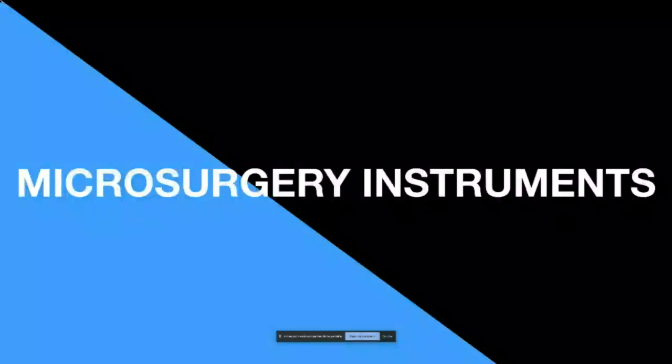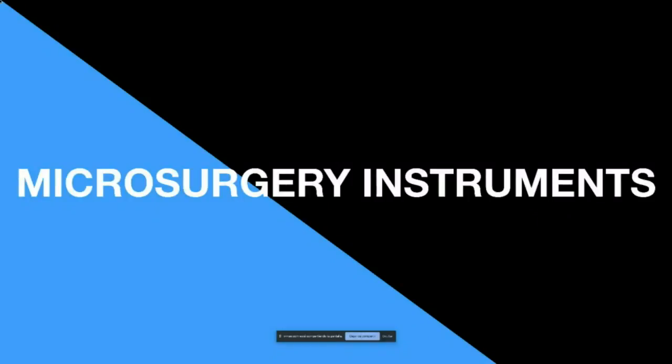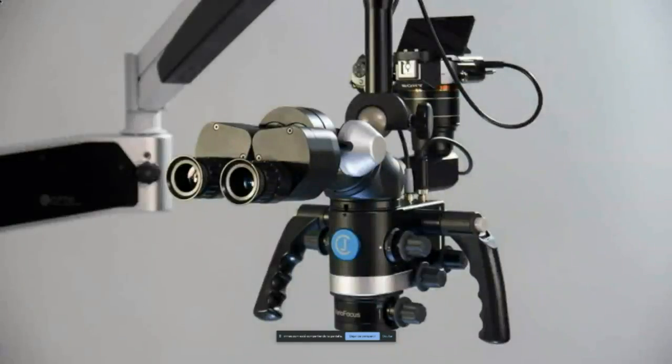So before I go to the case, it's important to note that we need to have some instruments, of course, micro instruments to make this kind of treatment. So, of course, in this case, I always recommend to use a microscope. Microscope is always mandatory to do some microsurgery, okay? It's no different from this case.